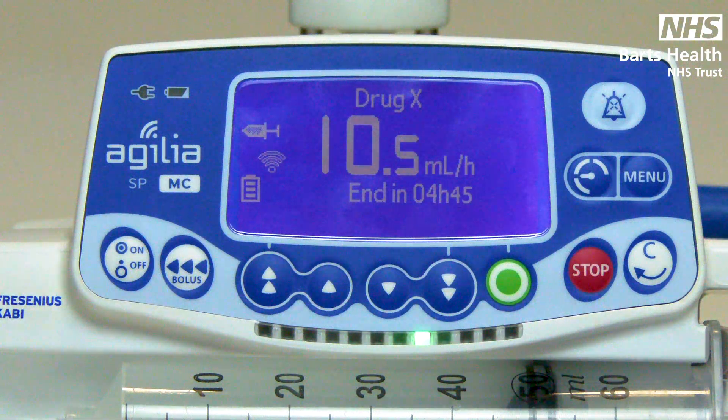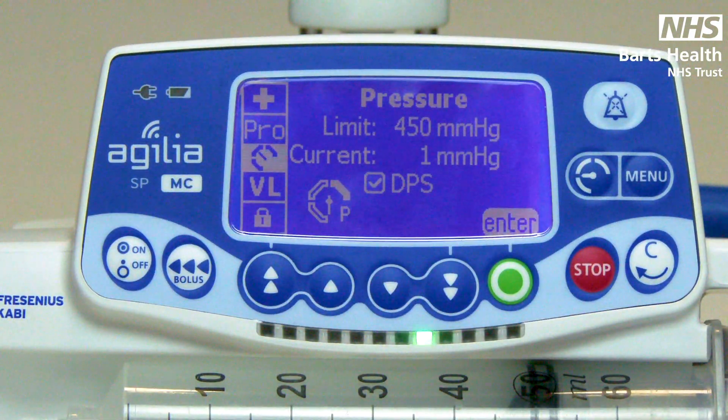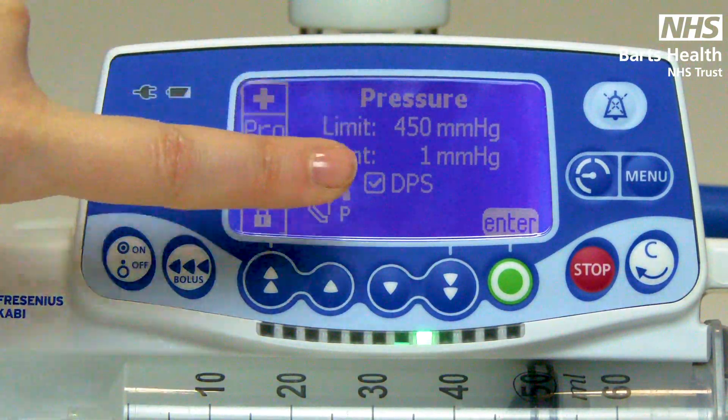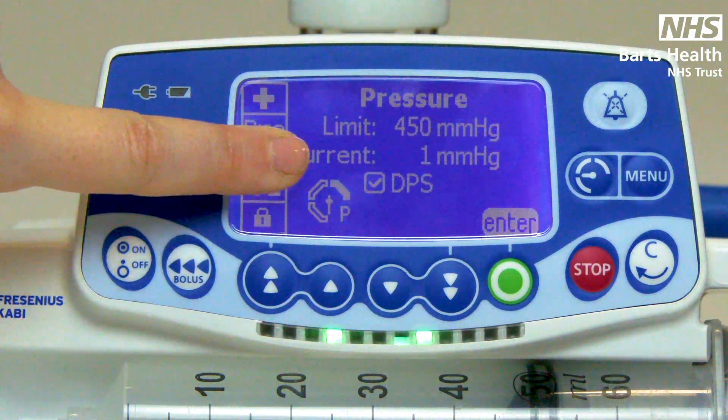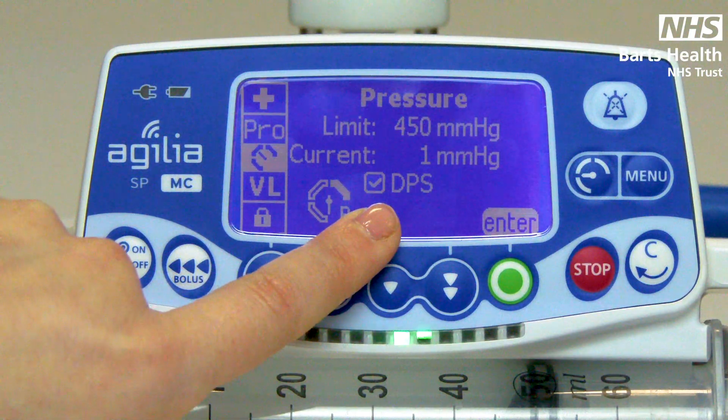To find your line pressures, you can use the shortcut key. At the top you will see the default limit, underneath the actual line pressure running, and then a box — tick DPS. DPS stands for Dynamic Pressure System.